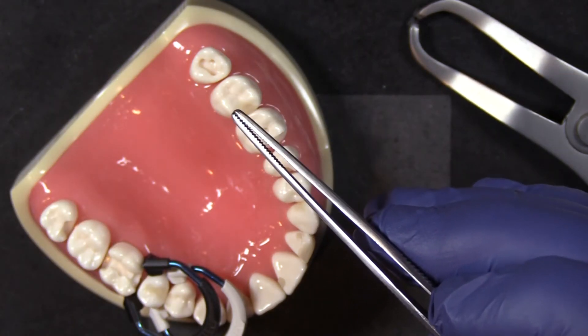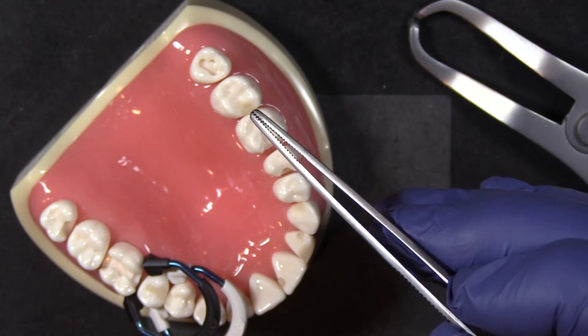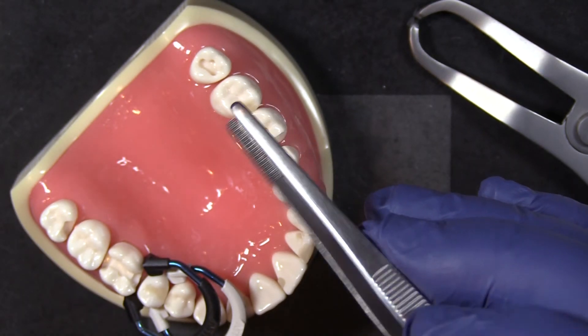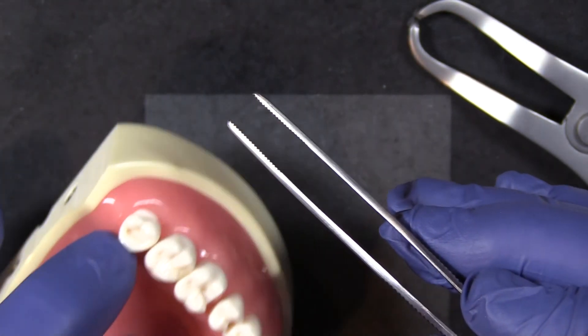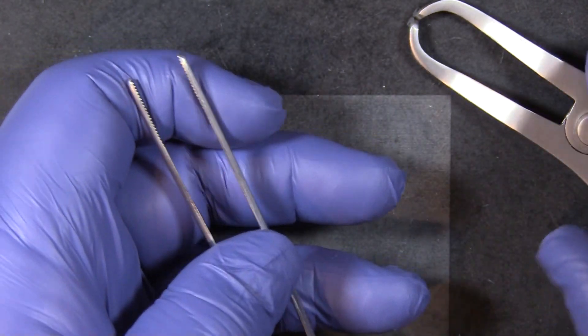but you've got the added grip and control for good wedge placement and then removal of the matrix band when the procedure is complete. Two instruments that are super helpful when you're using the Nitin sectional matrix system.